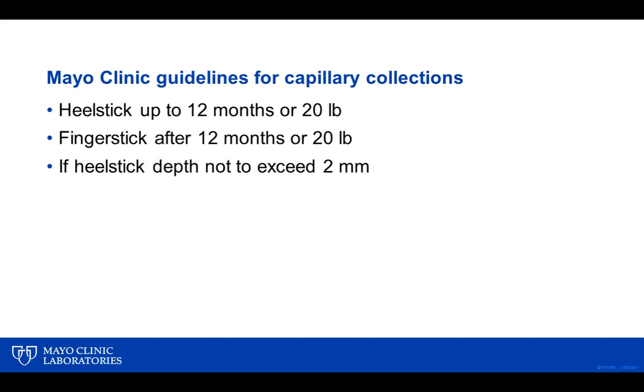So guidelines at Mayo Clinic, we do heel sticks in infants up to 12 months of age or 20 pounds. After that, we have to do finger sticks in adults. And so we basically have those two sites. In Europe and other countries, the earlobe is an alternative to the finger stick for glucose monitoring, capillary glucose monitoring. It's the other site on the body that has very rich capillary blood.